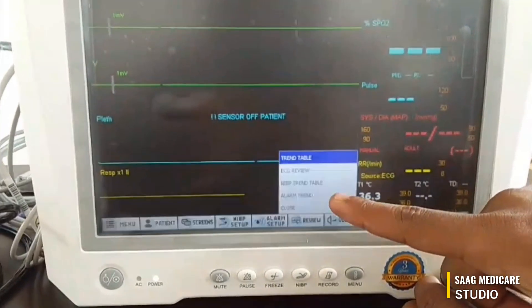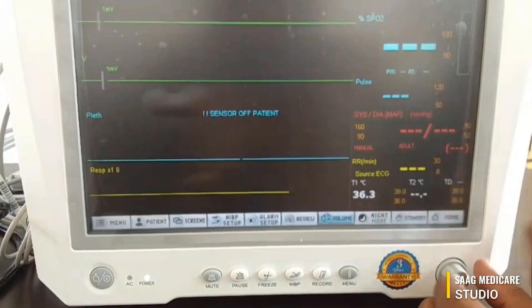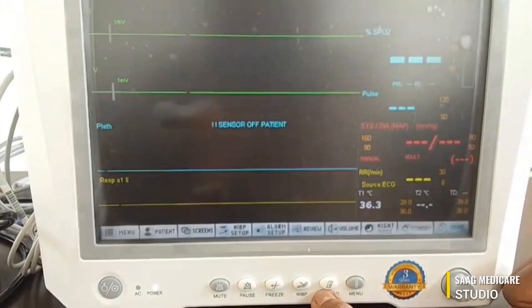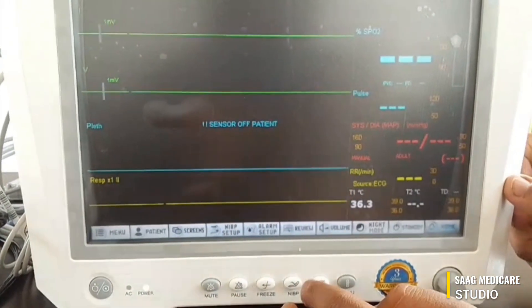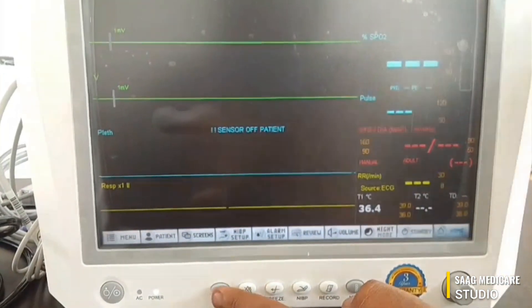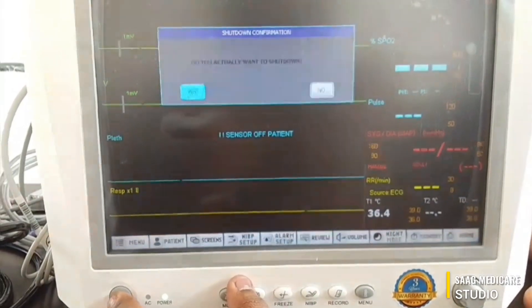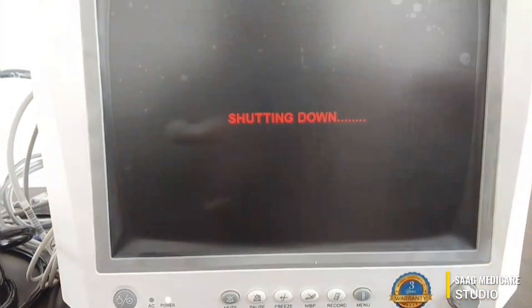In the review section you can see ECG review, NIBP trend, and alarm trend. You can change to night mode or put the device on standby mode. There is also a home return button. The record button is used to record data. You can press the NIBP button to start a NIBP measurement, and you can freeze the waveforms. The pause button and mute button are used to mute alarms. To power off the device, just press the power button once and select yes — the device will automatically shut down.